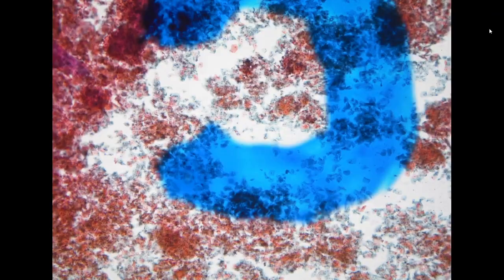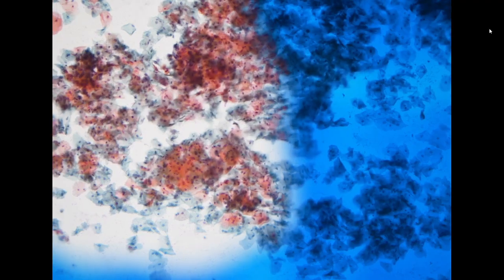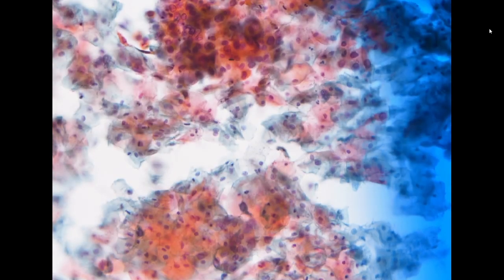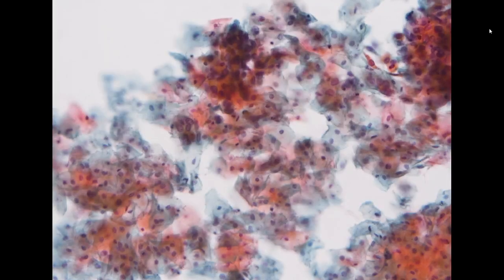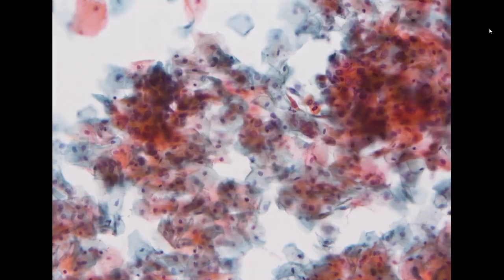So the next specimen, this is the prior specimen from this patient, CIN2, like 6 months or 4 months before. But she received a biopsy which showed negative. And so she has gone back to pap smear as follow-up, but we still see something like this. So I'm still calling this CIN2, okay?